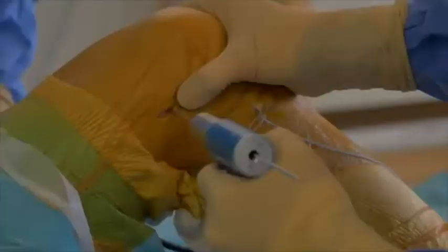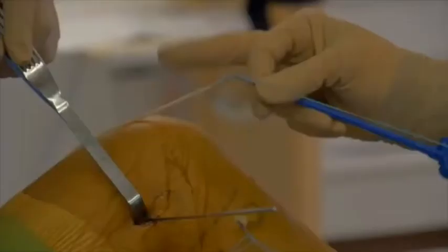Next, a 2cm incision is made slightly posterior and proximal to the lateral epicondyle. A K-wire is inserted, overdrilled, and the ALL graft is secured with a swivel lock.